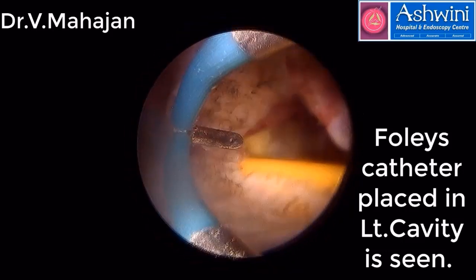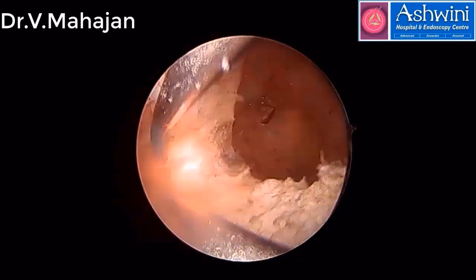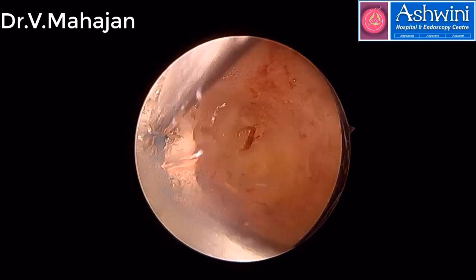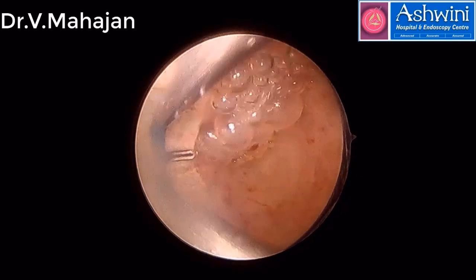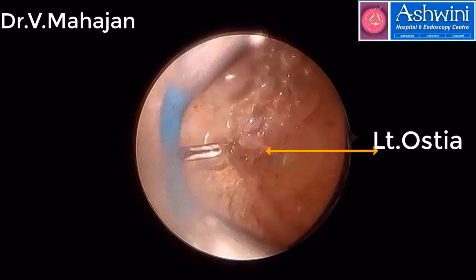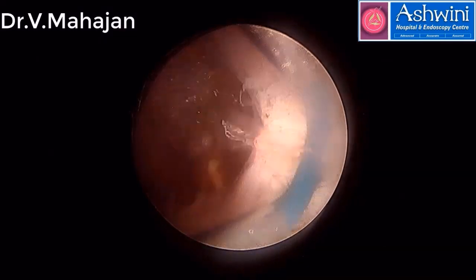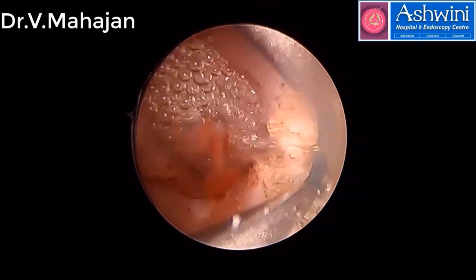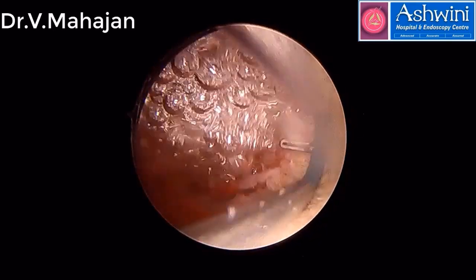Now we start cutting the septum. And remember, while cutting the septum, you should be able to keep your eye on both the ostia. Go in the center of the septum. Whenever you are in doubt, retract towards the internal os. Watch the septum, watch the ostia, and then you start cutting. Don't be in a hurry to cut. It is always better to undercut the septum rather than overcut the septum. Don't start doing heroic things. Always remember, undercutting of the septum is better than overcutting.